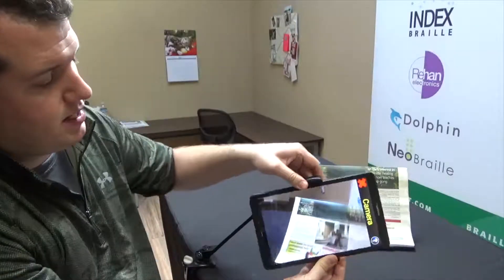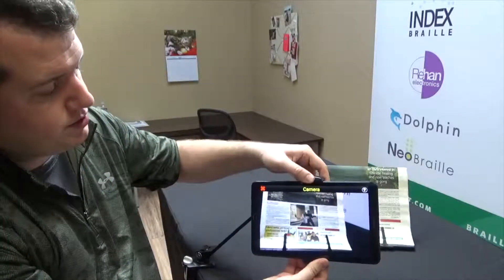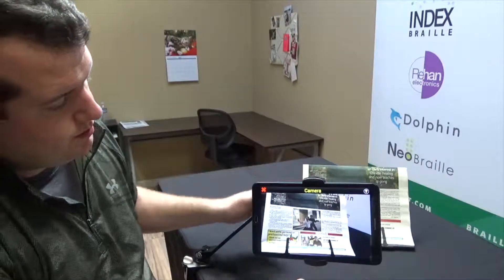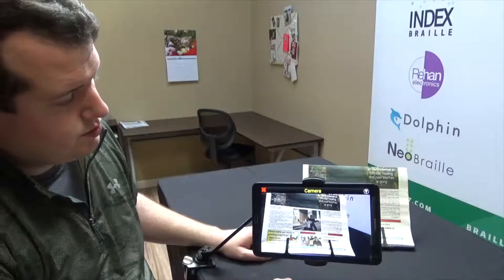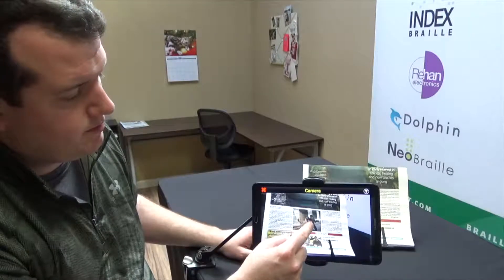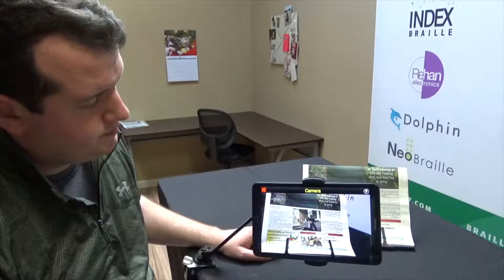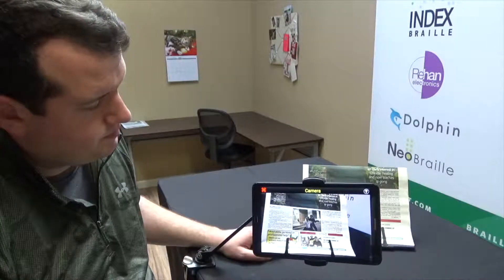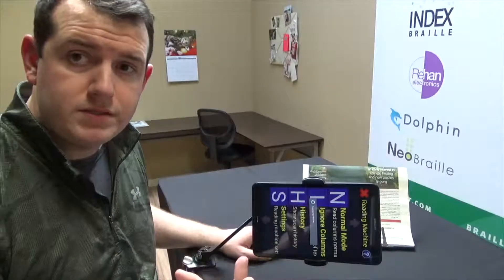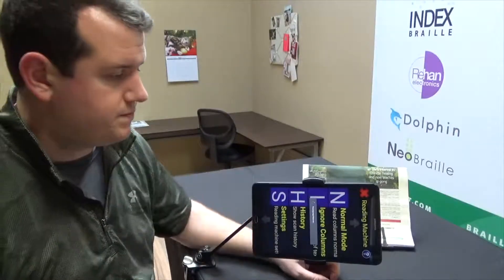I'm going to rotate my tablet sideways just to get a good angle, and now I'll tap on the screen. It's going to process the image and then read it aloud to me.